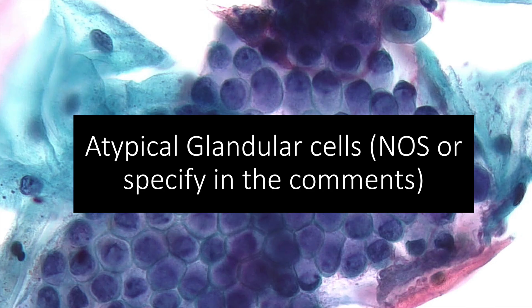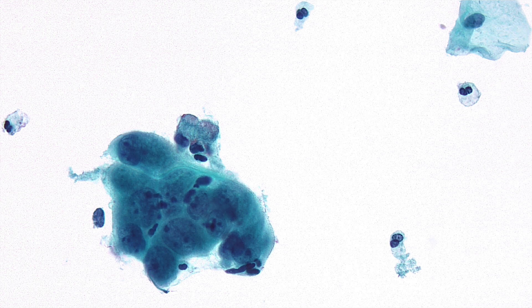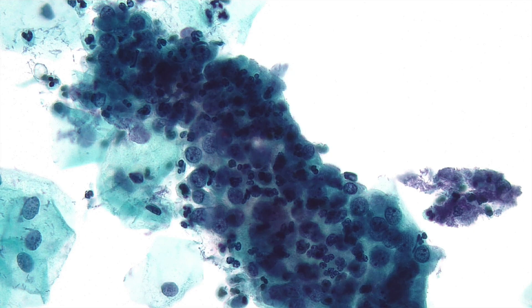The AGC NOS category is used when it is not possible to give an origin, and origin should be indicated whenever possible. Cells are in sheets and strips with some crowding and overlap. Nuclear enlargement is three to five times a normal endocervical cell. There is mild nuclear hyperchromasia, mild chromatin irregularity, rare mitotic figures, and increased nuclear-to-cytoplasmic ratios, but still relatively abundant cytoplasm.